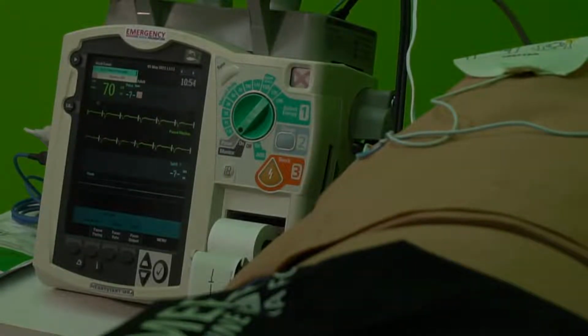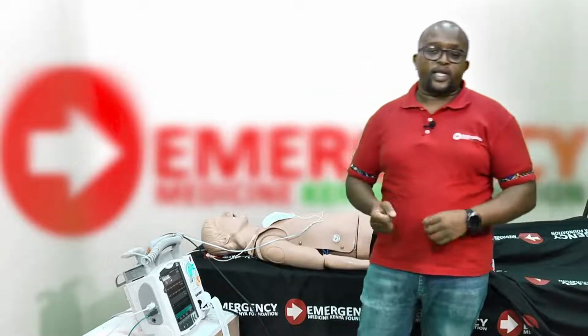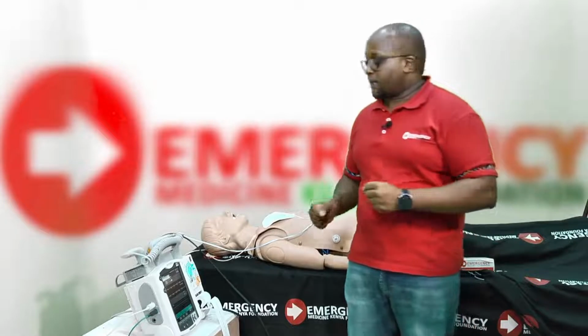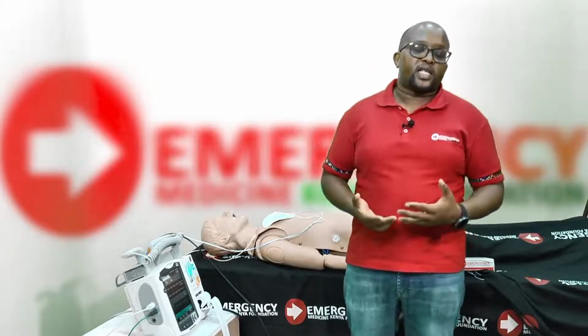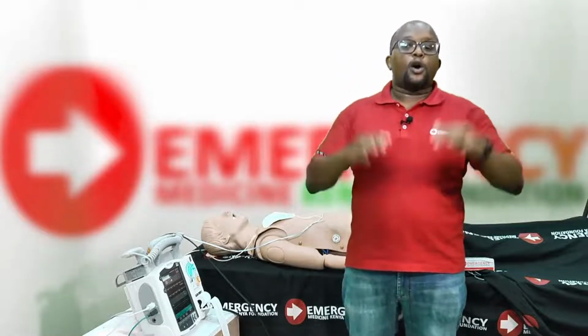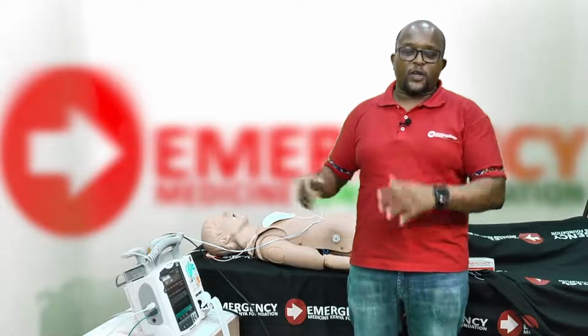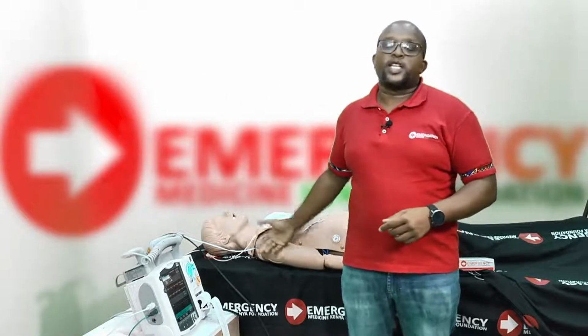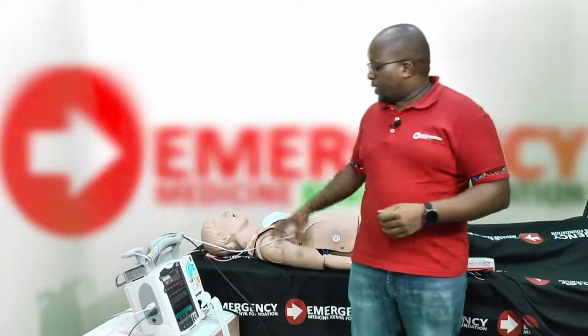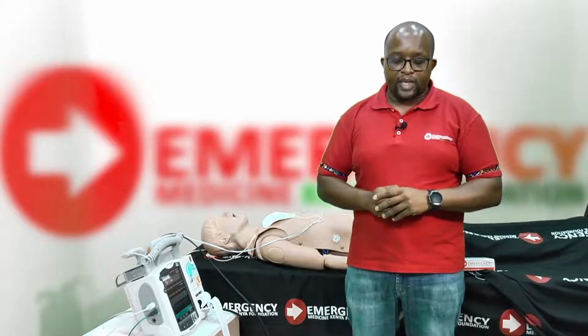In the emergency setting, our patient is temporarily there with us. That means we'll be moving the patient either from the emergency department to the coronary care unit, or in an ambulance. In that situation, monitoring the patient becomes a bit hard to make sure that the machine is constantly pacing. With the bumps, especially where you have potholes, and holes on the corridor, and the bumping of the stretcher, the machine could easily pick up that and say that's the patient's heart rate and go into standby mode.